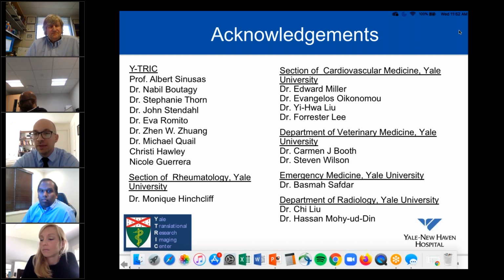That's the current recommendation. Maybe we could introduce PET a little bit earlier, and as invasive methods only look at epicardial disease, I think the use of PET flow reserve can show some insights into microvascular disease as well. The important point. And how about the relative use of PET versus dobutamine echo?